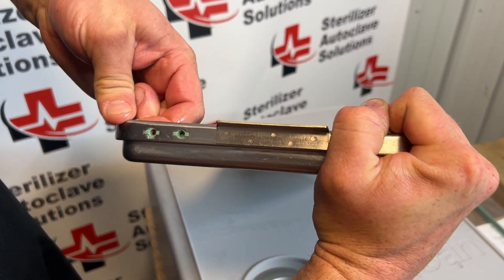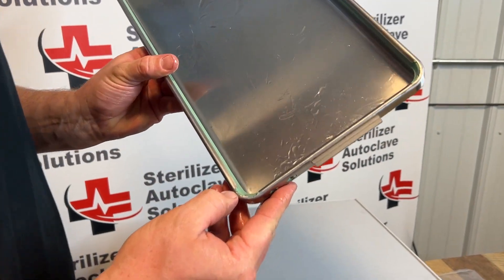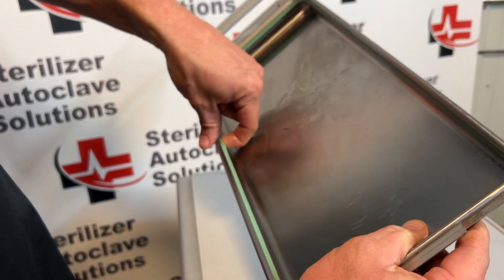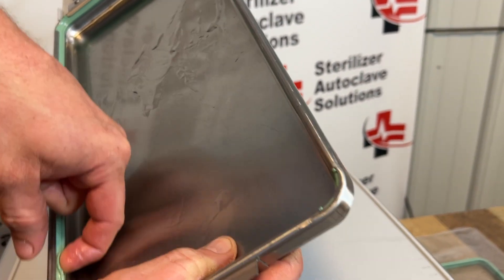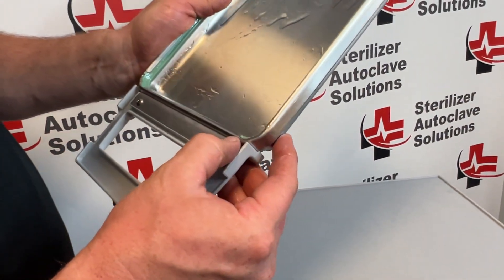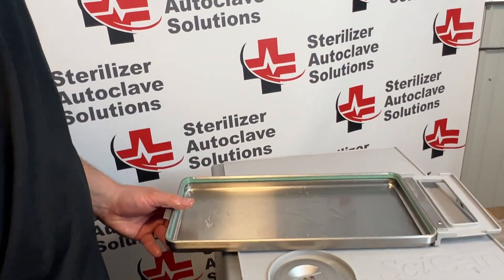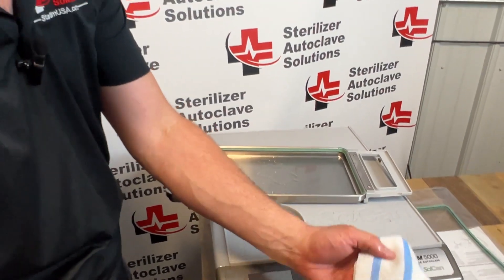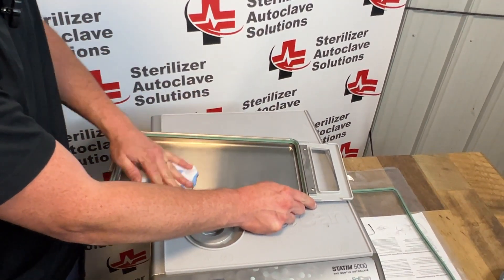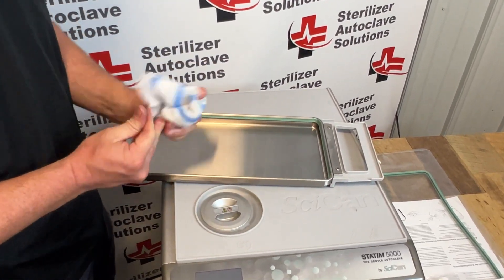That looks pretty good. We want to inspect the corners and make sure that our nubs are in the corners. If you do need to adjust, you can put your finger in the groove and slide. Once confirmed, I'm going to wipe out this cassette. This will leave residual water on your lid — you can use Stat Dry to cut down on that oil.